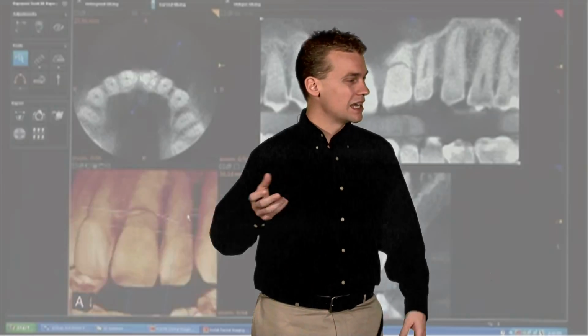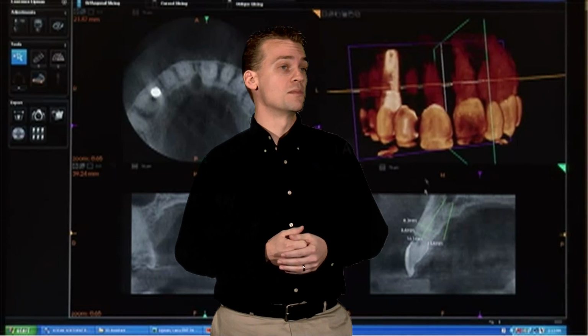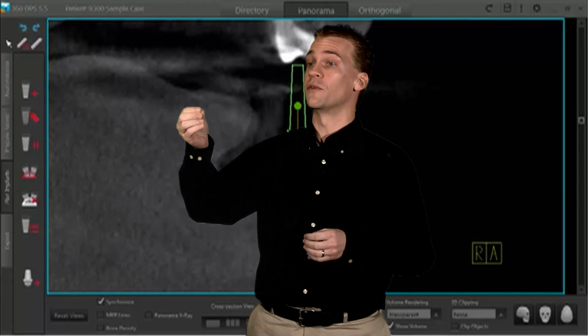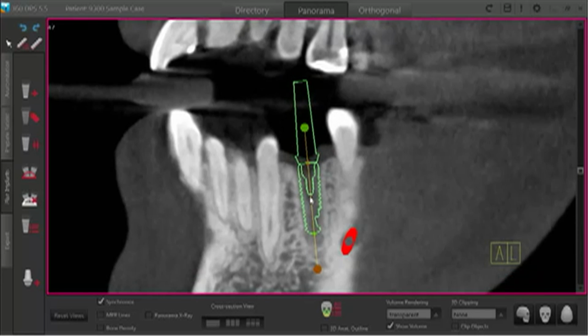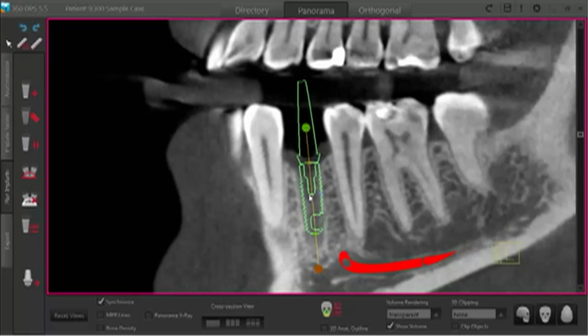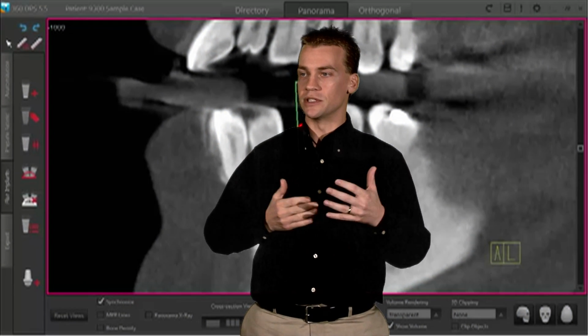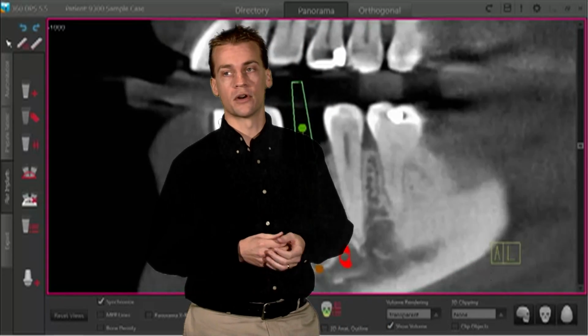So a focus field or dual mode cone beam CT gives you that 2D image, and it also gives you a focus field 3D, about 50 by 38 millimeters, depending on which model you choose. And one of the newcomers to the market that are just really neat and have some amazing clinical applications are variable field of view CBCTs. Now, depending on the type of case that you're working on, you can actually select different modalities within a single machine with a single sensor. There's lots of options that you can do with these multi-modality machines, and for that reason, they've become very popular.